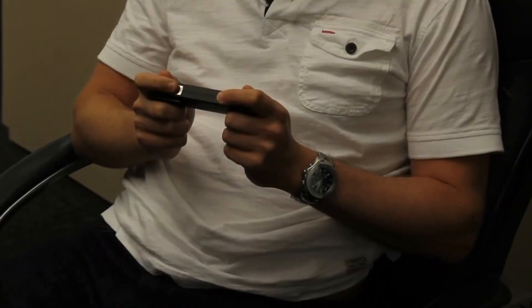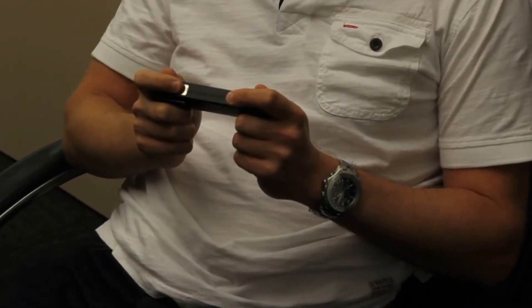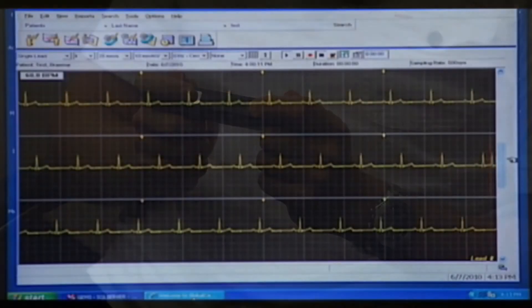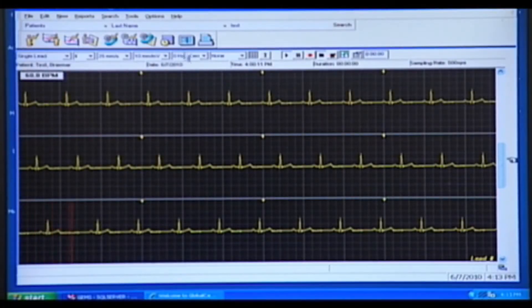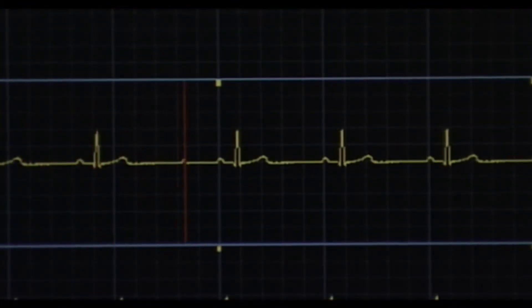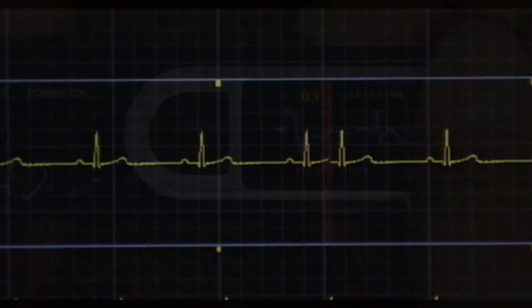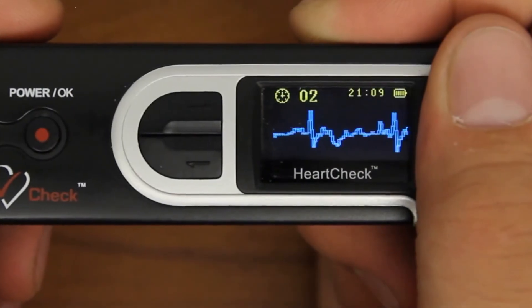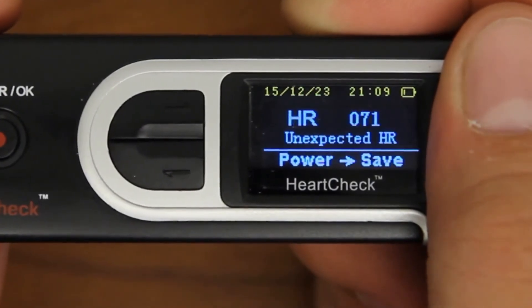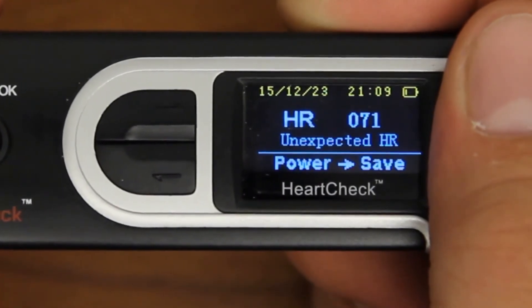Since everyone's body type is unique, a hand measurement may not necessarily produce the highest quality ECG reading in all people. Some ECG readings may produce an ECG waveform that is not clear enough for a healthcare professional or physician to make an accurate diagnosis. A common indicator that the ECG reading may be unclear is that after the reading is complete, the monitor displays an unexpected heart rate message.